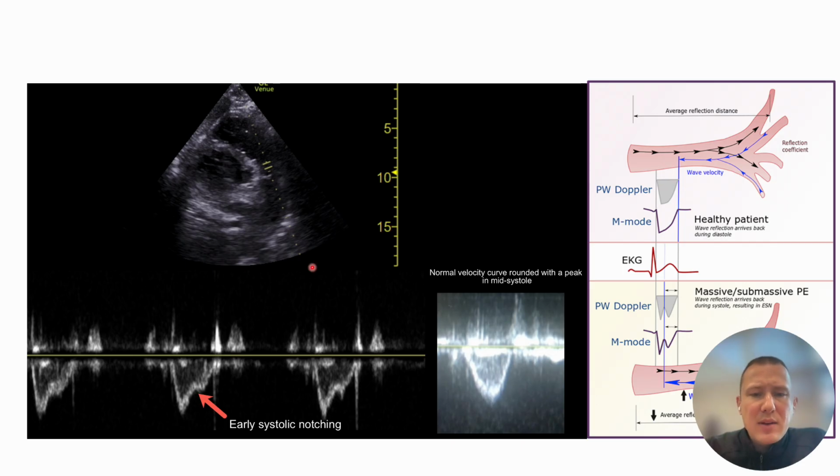One of the other clues that we use clinically to differentiate different problems that can lead to interface 4 uncoupling is by examining the shape of the RVOT VTI waveform. If we look for early systolic notching, and that notching is present during systole, that would be highly indicative of acute pulmonary pressure elevation that we see in pulmonary embolism patients.